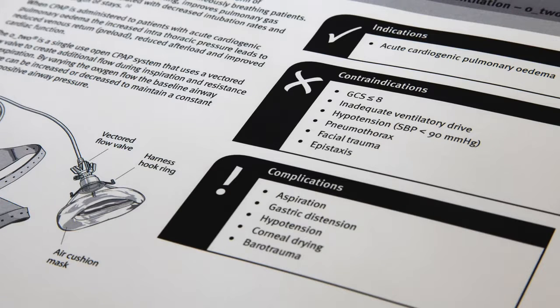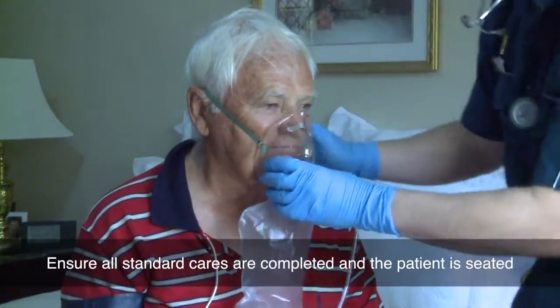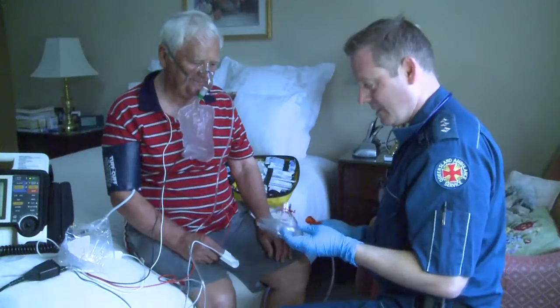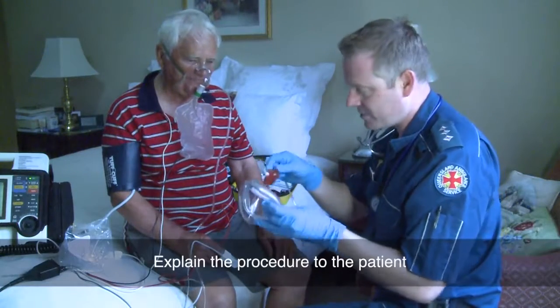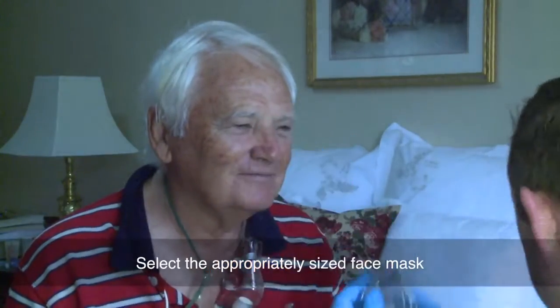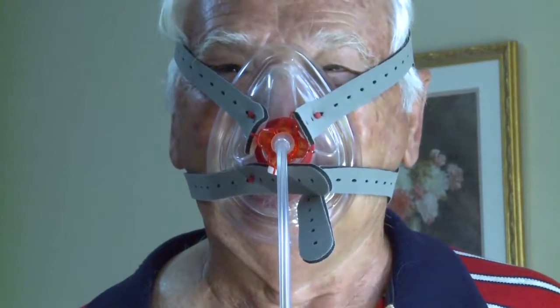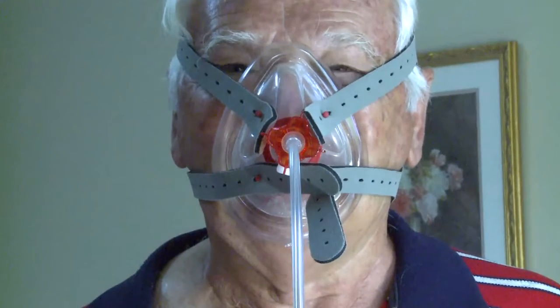Let's now look at the practical application of the O2 CPAP device in the field. Ensure all standard cares have been completed and ensure the patient is in a seated position. Explain the procedure to the patient, as patient understanding and cooperation is essential for the success of CPAP. Select the appropriate size face mask, ensuring that the inner circumference of the air cushion encompasses the bridge of the nose, side of the mouth and the inferior border of the bottom lip.